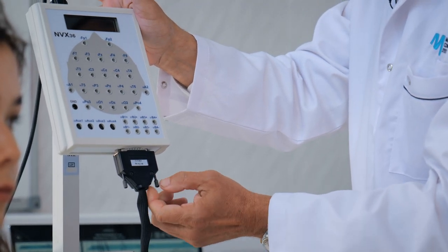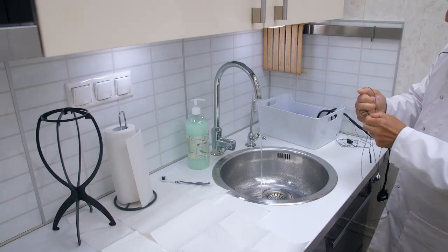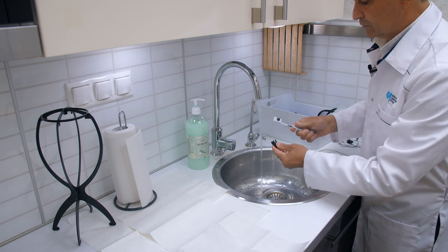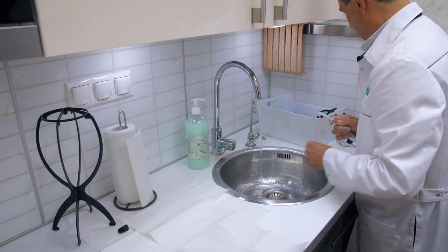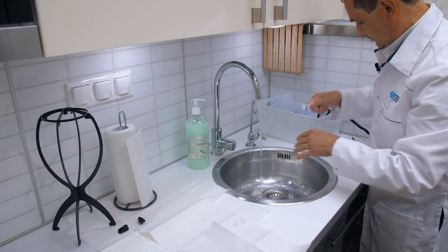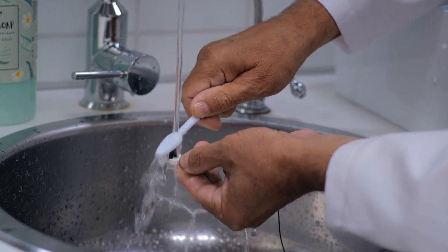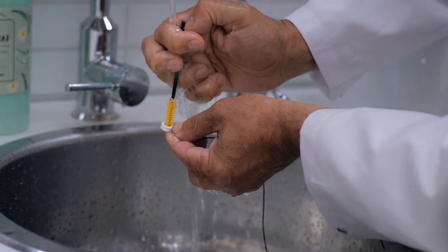While the gel is not yet dry, wash the cap. The cap is washed under a steady stream of water — the gel washes off very well. We start washing the electrodes and cap thoroughly to ensure proper cleanliness and hygiene. The ear clips should be addressed first; then utilize a used toothbrush to cleanse any gel residue. We wash the hair clips and promptly remove them onto a paper towel or absorbent towel, which ensures effective drying.